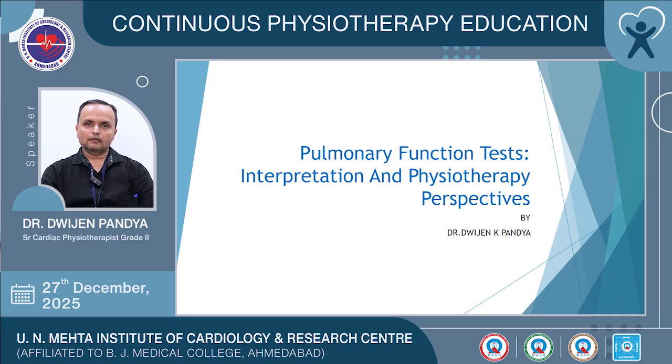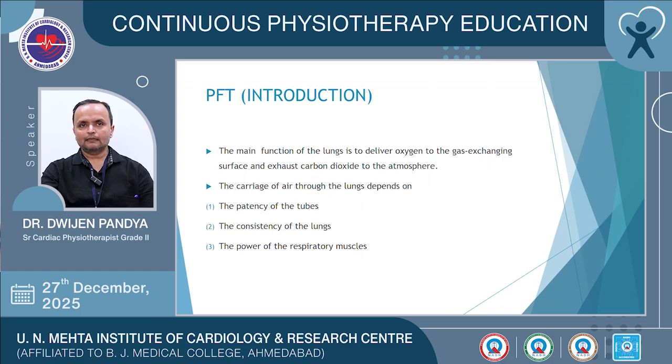Today, my topic is pulmonary function test, interpretation, and physiotherapy perspectives. As the name suggests, pulmonary function tests are those tests conducted to measure the various volumes and capacities of the lungs. Now we know that the main function of the lungs is to deliver oxygen to the gas exchanging surface and exhaust carbon dioxide to the atmosphere.